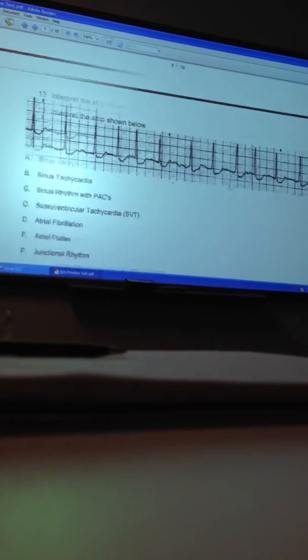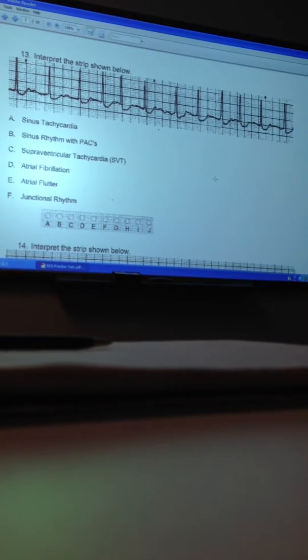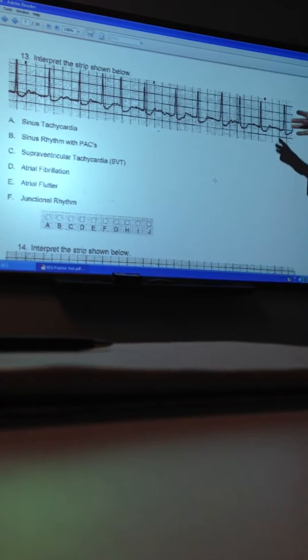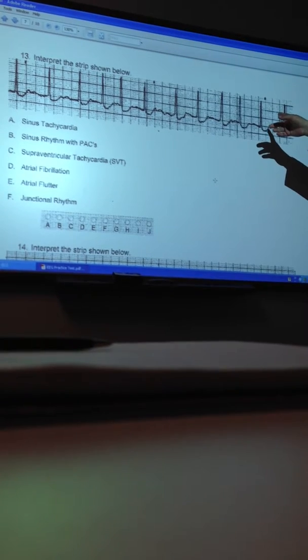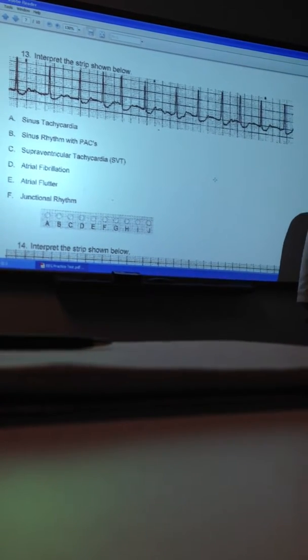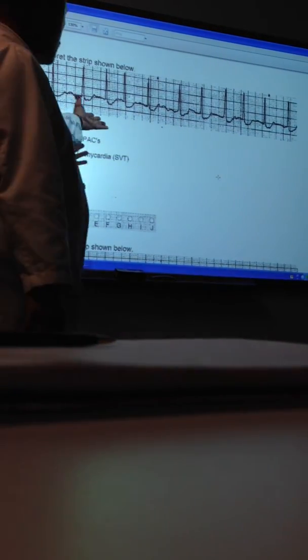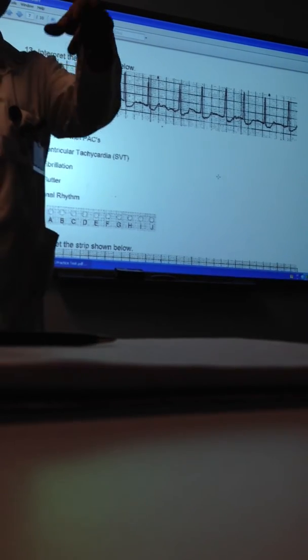This is good, actually. So what am I saying? Thanksgiving. What do I got? Tell me. Is it sinus tack? Is it sinus tack? Yes. Yes. Let me see your glasses. Do you see P waves? No. Thank you. Do you see P waves? Thank you.